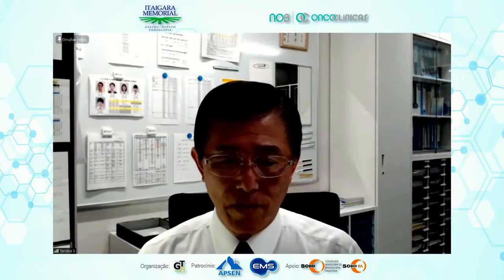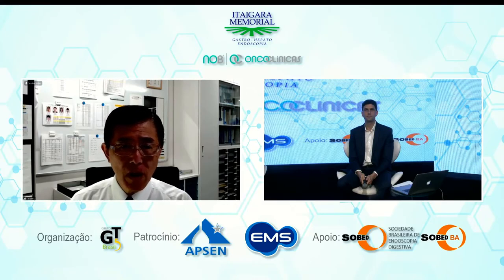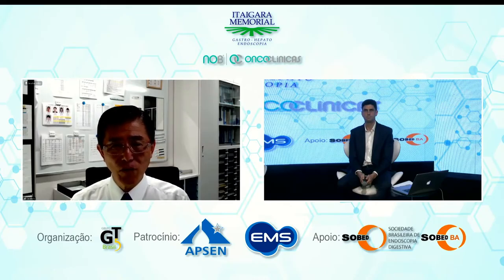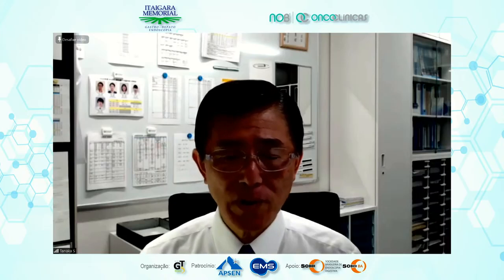Soon, in Japan, and maybe all over the world, the Olympus company will release a new version of the endoscopy system, the successor of Lucera Elite. This system has an almost autofocus magnifying function. So in addition to the launch of this new modality, NBI and pit pattern magnification will spread all over the world.